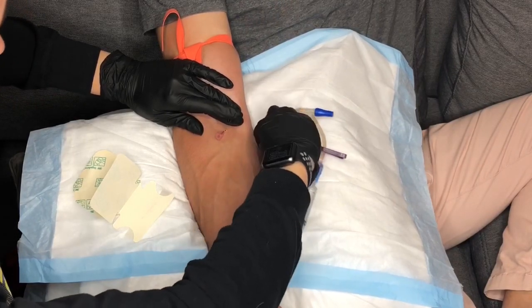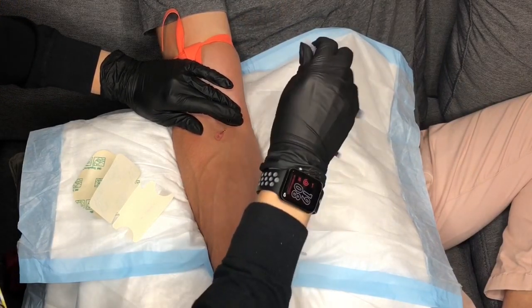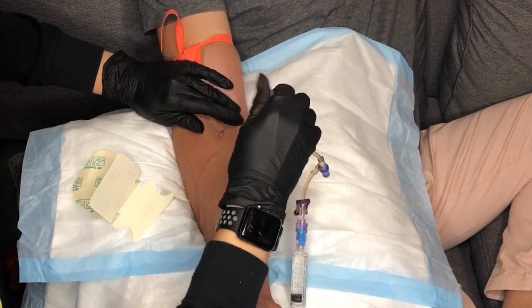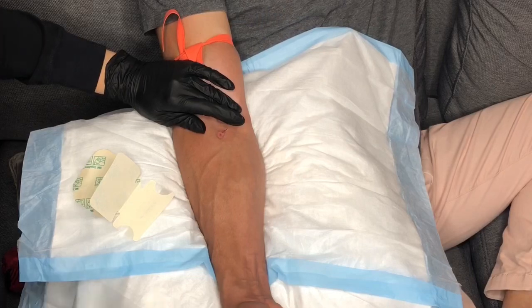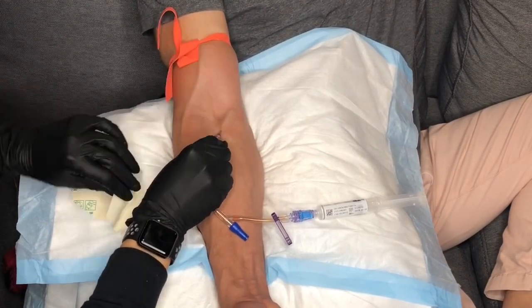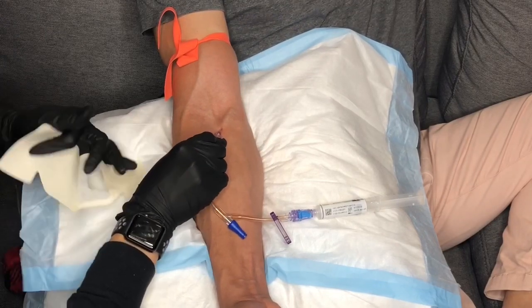try not to feel as if you're hurting the patient by applying pressure with your fingertips, for the catheter is made up of soft and flexible tubing. It may be uncomfortable, but spilling blood will cause the patient to become even more uncomfortable than the pressure felt by your fingertips.